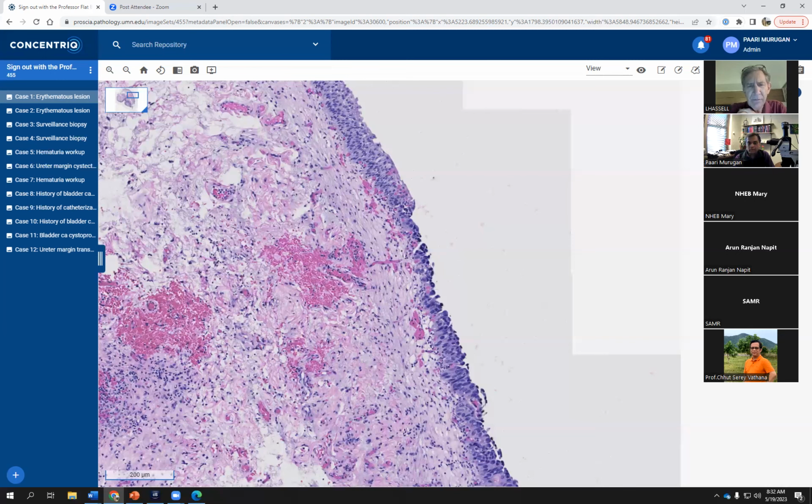You see it, as you know, in female genital tract and uterine malignancies as well, the null pattern of P53 in serous carcinomas and ovarian carcinomas. So the same thing can happen in bladder carcinomas too. When there is P53 mutation, you can occasionally see a null pattern, which is what that case was. The important thing is to understand that this is also possible as a form of P53 mutation. You may not always see an intense staining of P53 in that situation. So that's a really good pickup. Thank you for highlighting that.